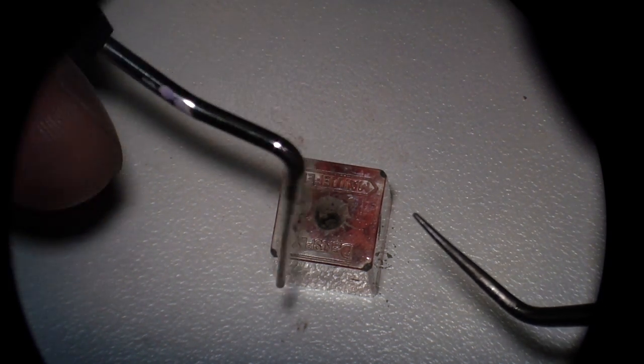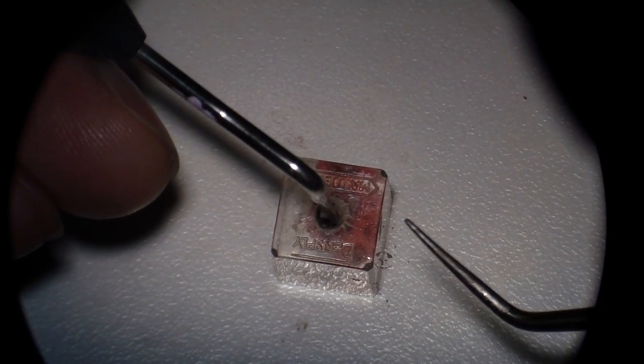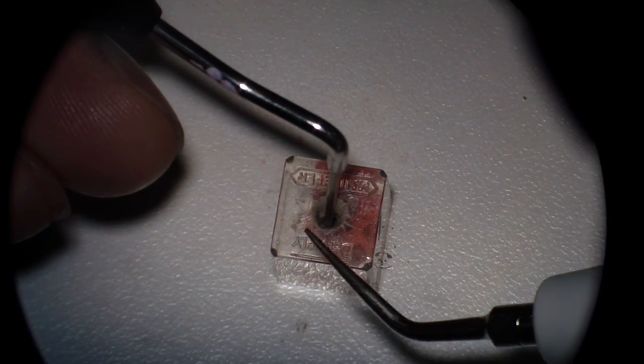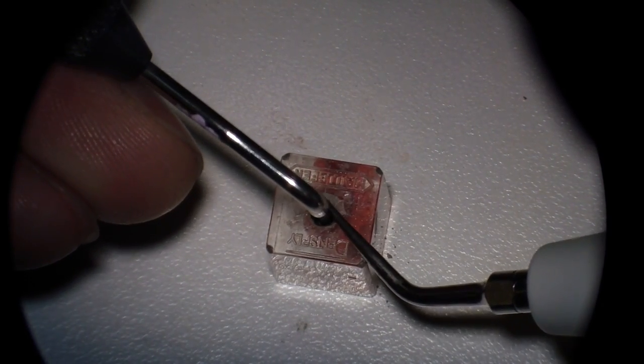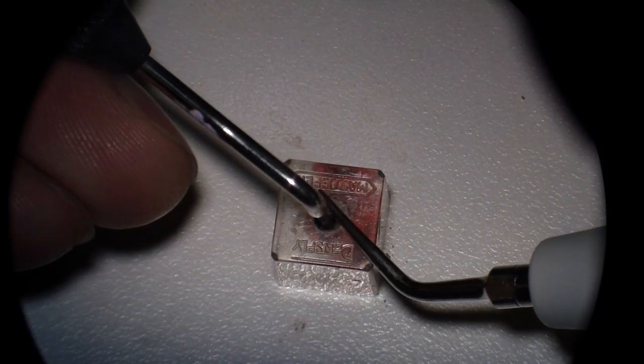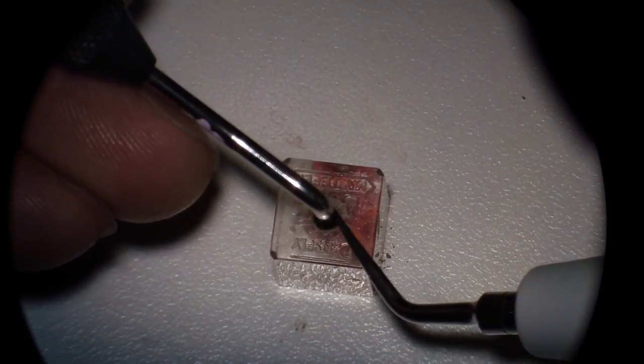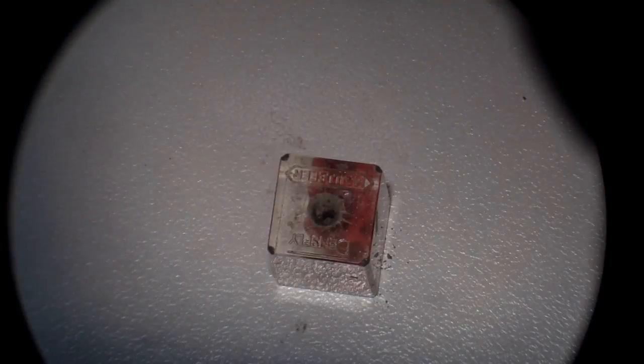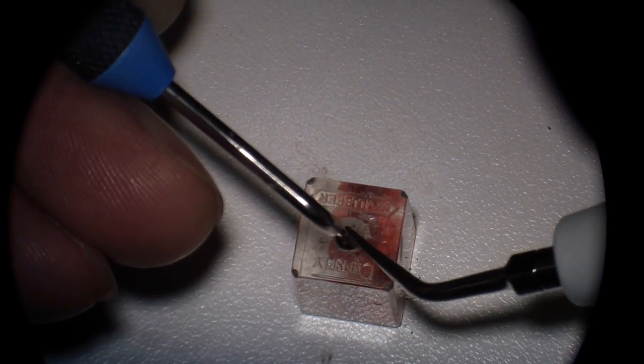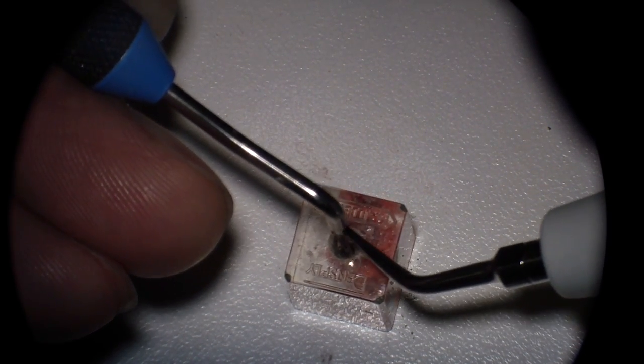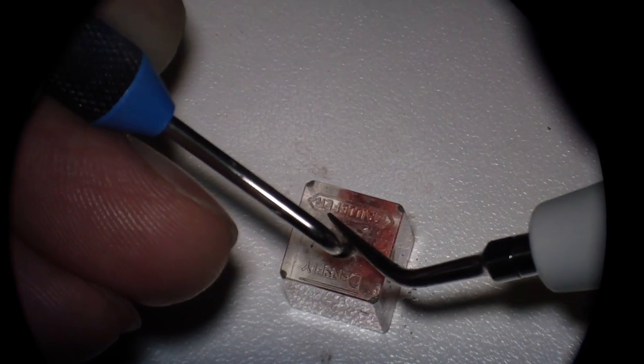So in an attempt to speed things up, I placed a few more increments of MTA. And what I wanted to do again was just to show the idea of using ultrasonic energy to condense some of the MTA. Okay, so we'll do it more coronally. So here's my condenser, and you can see where we are here. So the idea is to take my condenser, make sure I have that on video. There you go. And just condense around the inside of the canal. So you can see you're taking my condenser. I'm going to stop and try that again. And I'm going to try the smaller one so that I can get a better view. So again, the idea is to take that and just walk all the way around the inside of the canal.